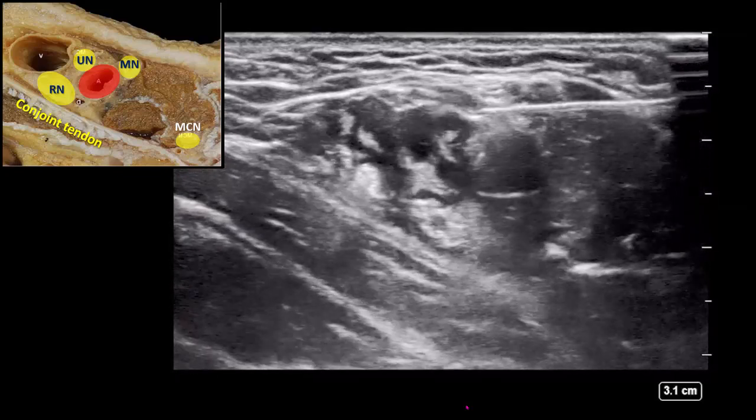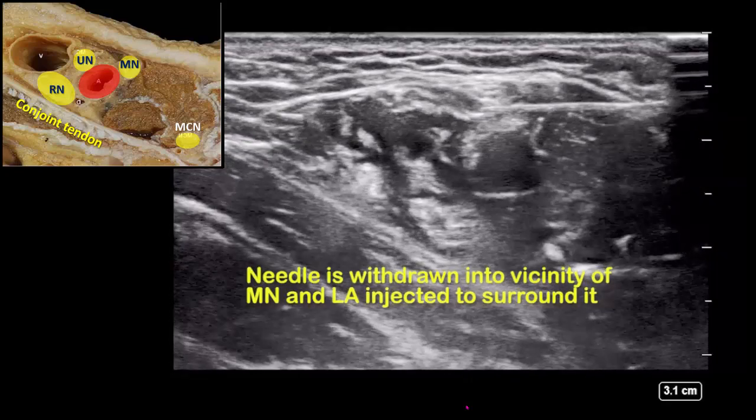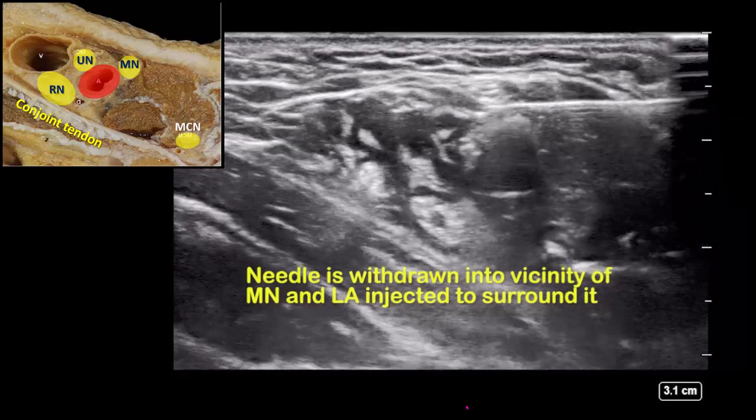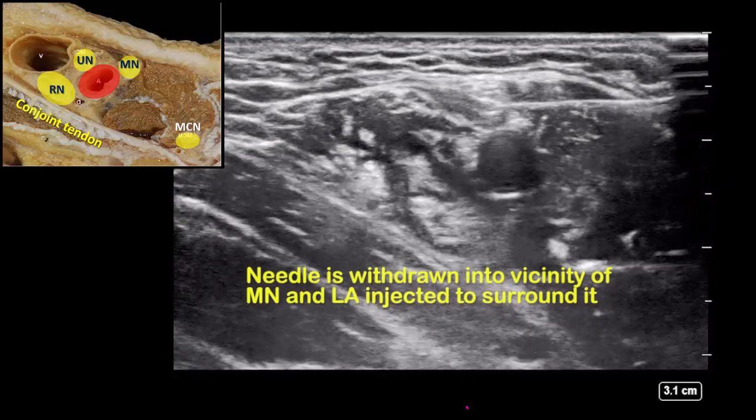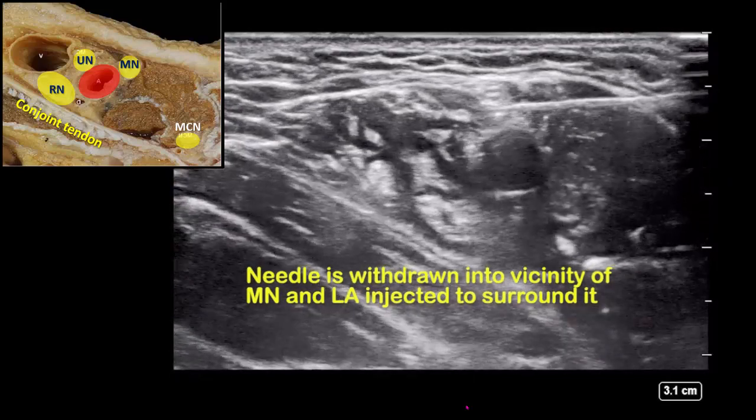Once ulnar nerve injection is complete, withdraw the needle into the vicinity of the median nerve and inject another 5 to 8 mils in total, repositioning the tip if necessary to obtain spread that surrounds the median nerve.